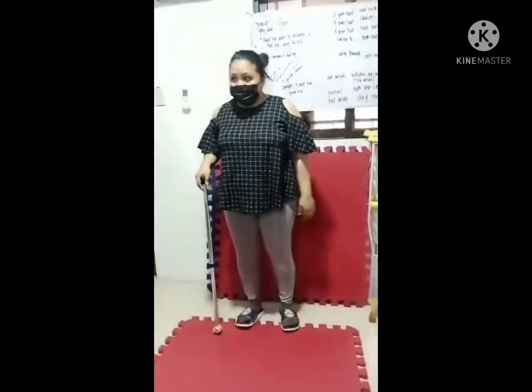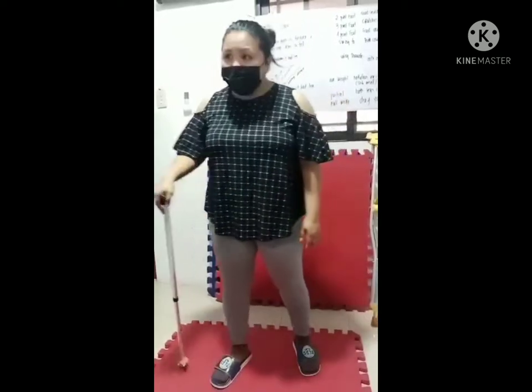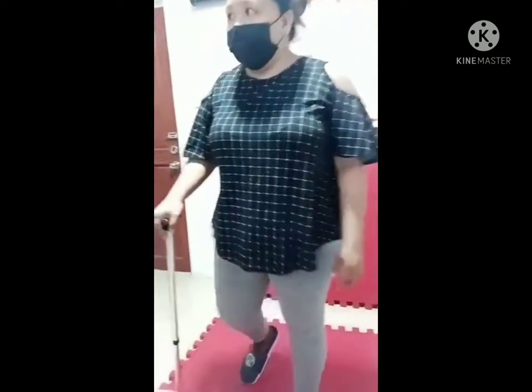Three-point gait: cane, bad leg, good leg. Cane, bad leg, good leg.